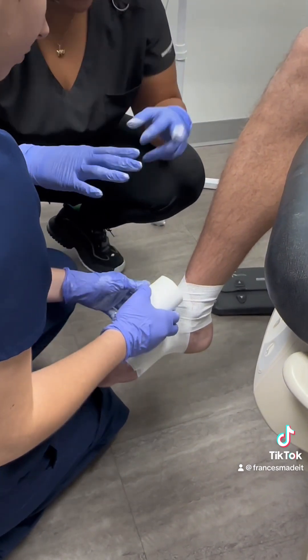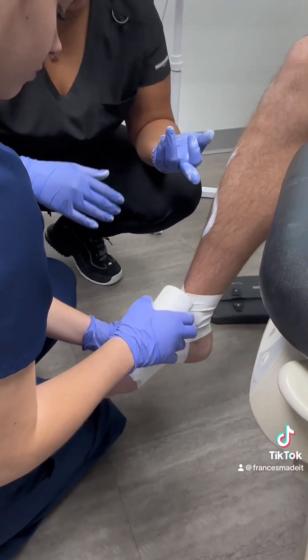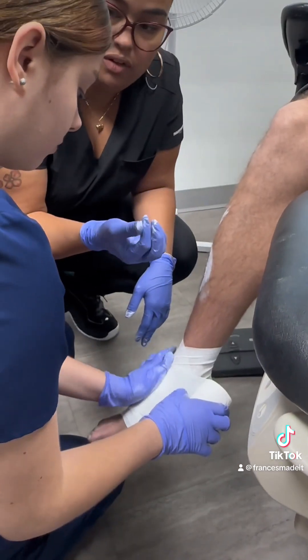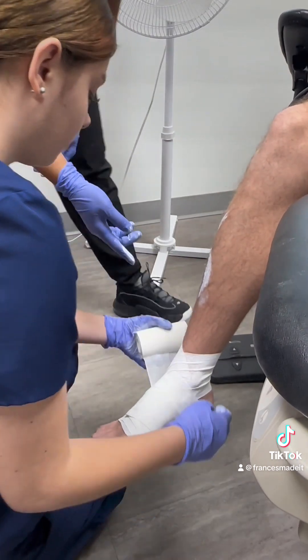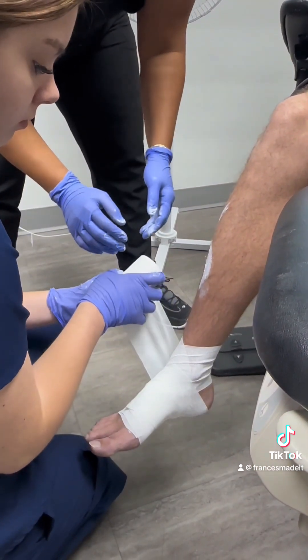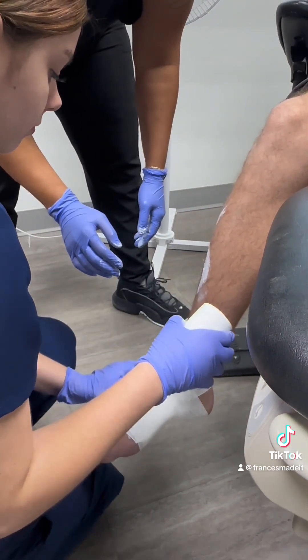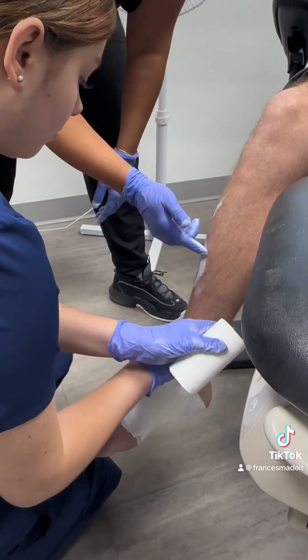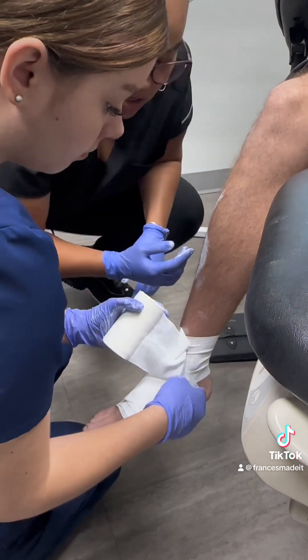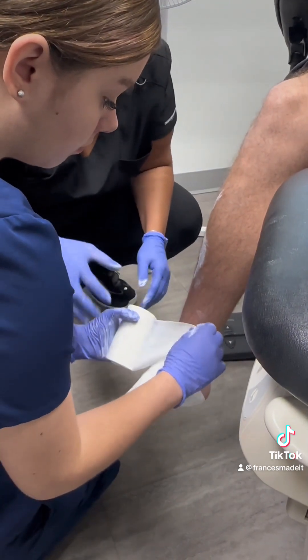This allows compression if there is any swelling. This is zinc — it's a healing agent for wounds and things like that. I like to tell the patient it's like a soft cast because it hardens up. When you do your folds, keep it nice and neat, and fold again, because it hardens up and could actually break skin if it gets too hard.